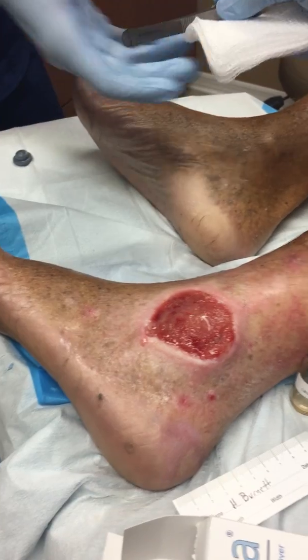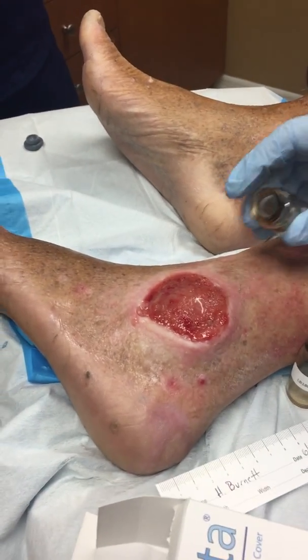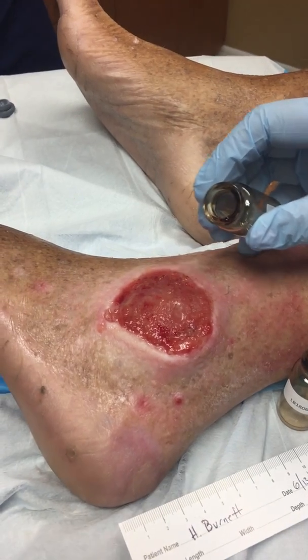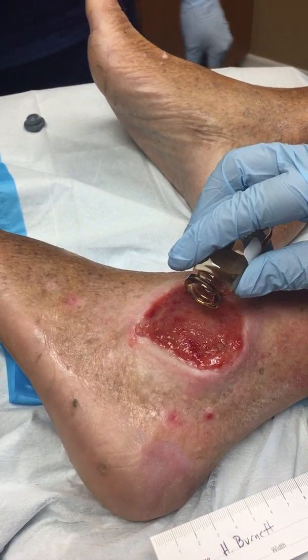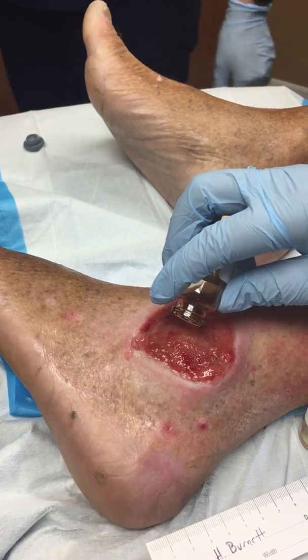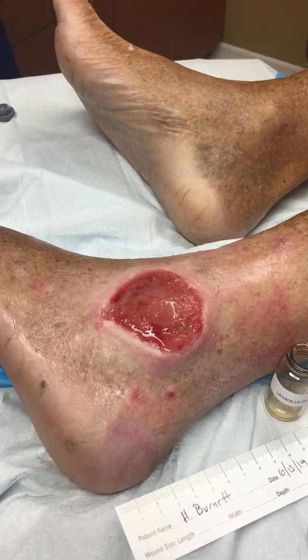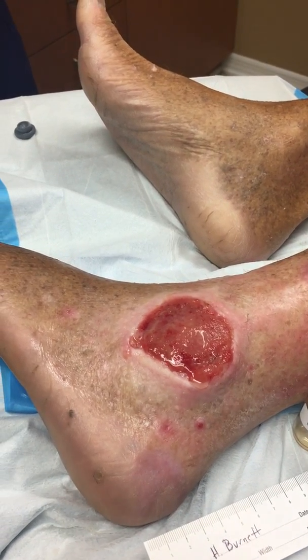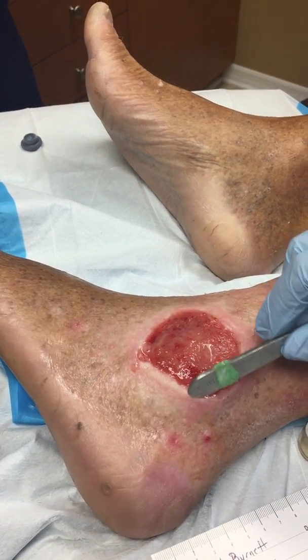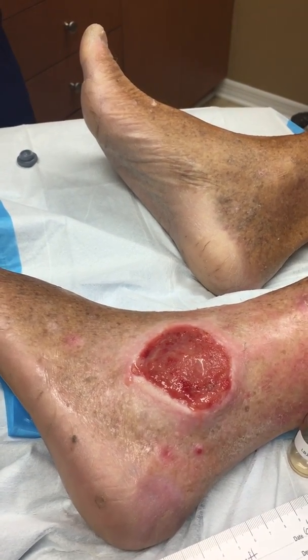The placenta is more or less going to act almost like a scaffold with this. So hopefully with the wound edges, it'll help the tissue migrate a little bit more towards the middle, and we'll get faster closure.